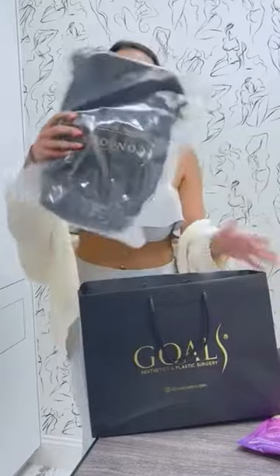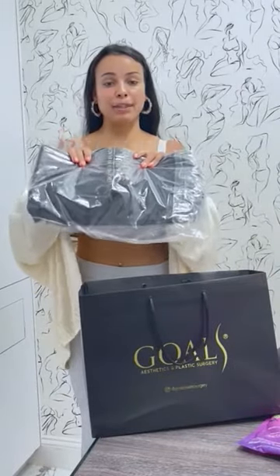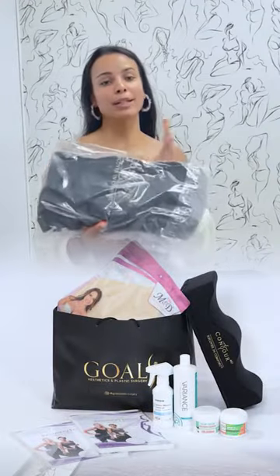And the last thing you'll get is a recovery pillow, where it'll make it so much easier to sit down because you will not be sitting on your butt. You'll be putting your thighs here and your butt will be sticking out on the sides, and will give you some comfort when needing to sit down.